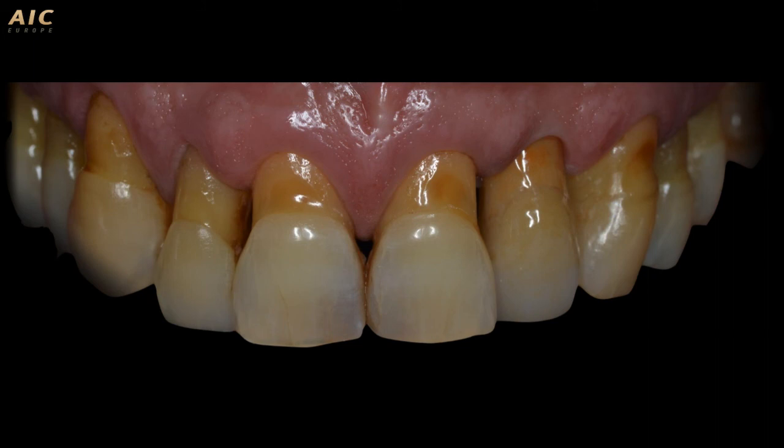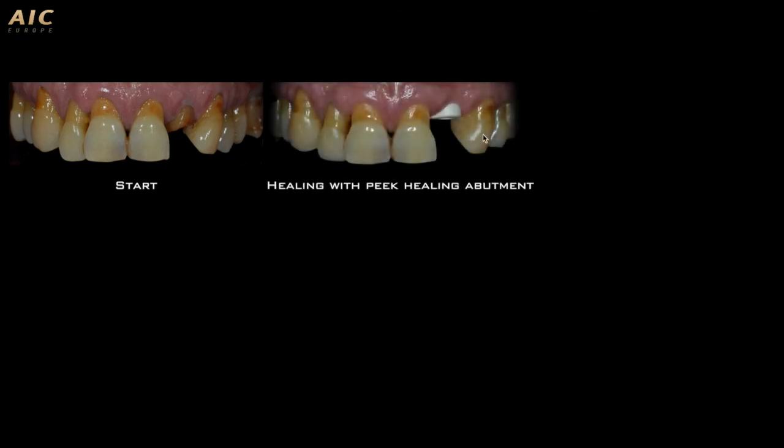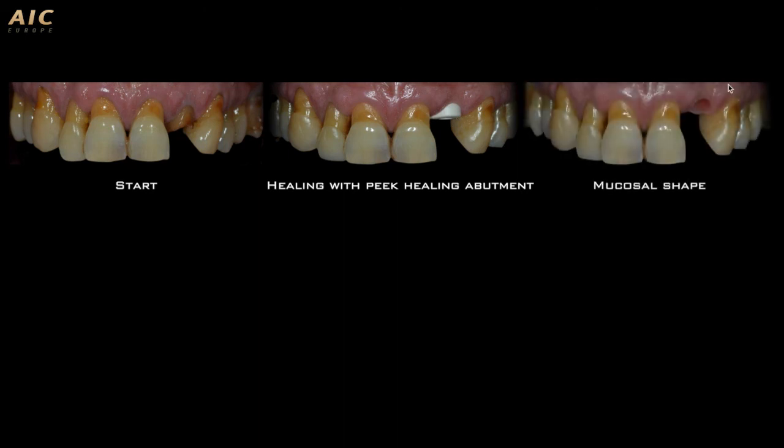Well, to finish this short webinar, I'd like to have a panoramic view of the clinical case. This is the starting point. We have this tooth that we must extract. This is the healing with the PEEK healing abutment, a very amazing tool thanks to Osstem. This is the shape of the transmucosal root thanks to the PEEK healing abutment.